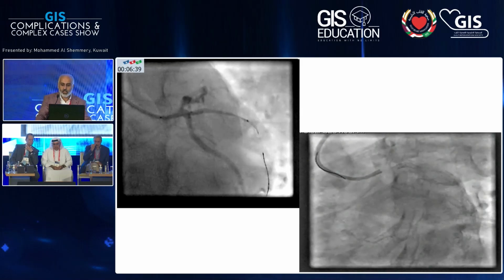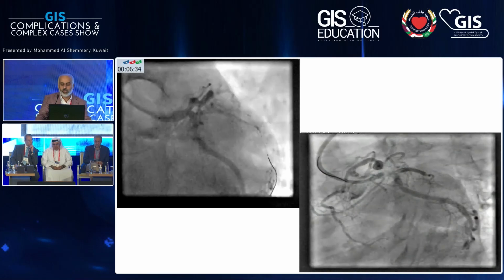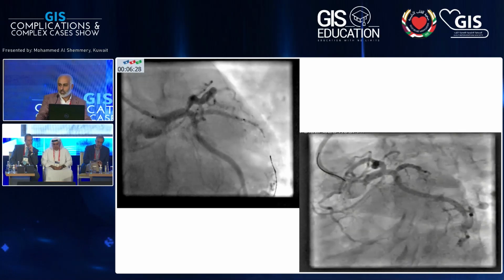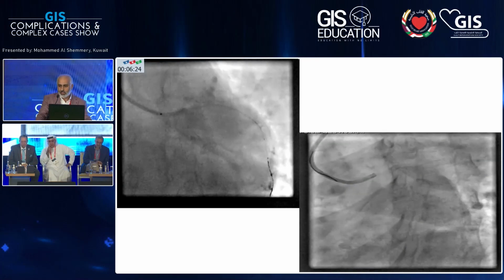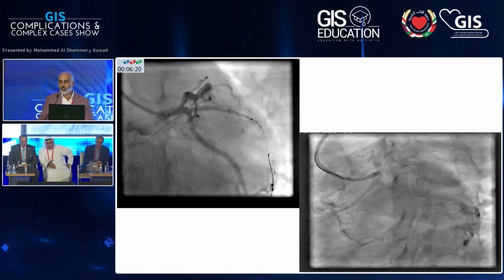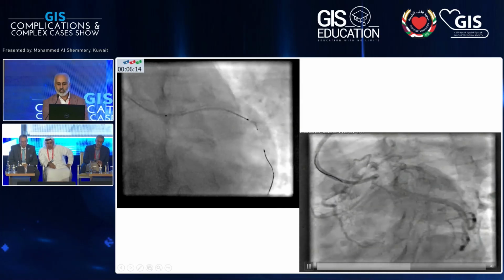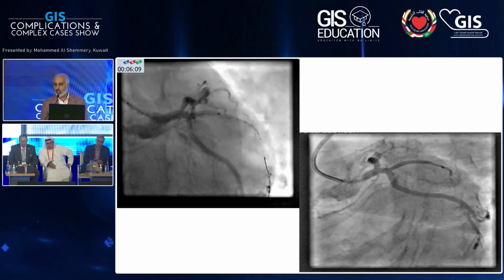And if you look at the picture on the right bottom there, this is the final result with a fairly obvious extravasation from a small branch of the OM. So this is the third decision we faced. The patient at this point had no symptoms. So I'm gonna point it out there. You could see towards the end of the picture there is extravasation. Patient has no chest pain.